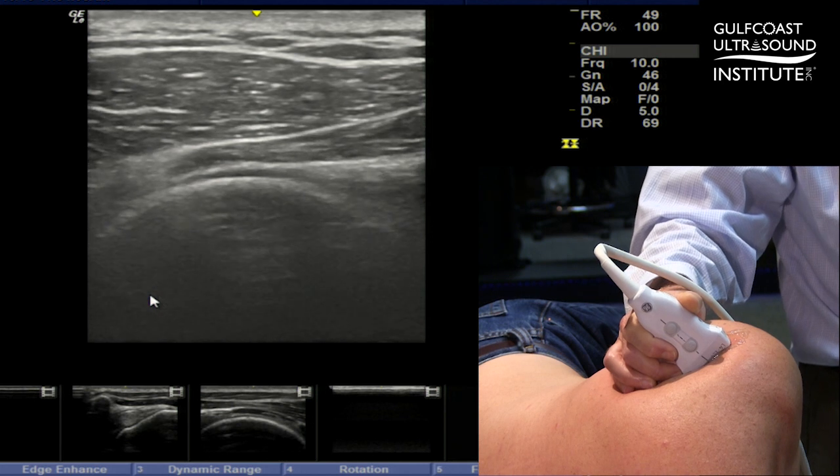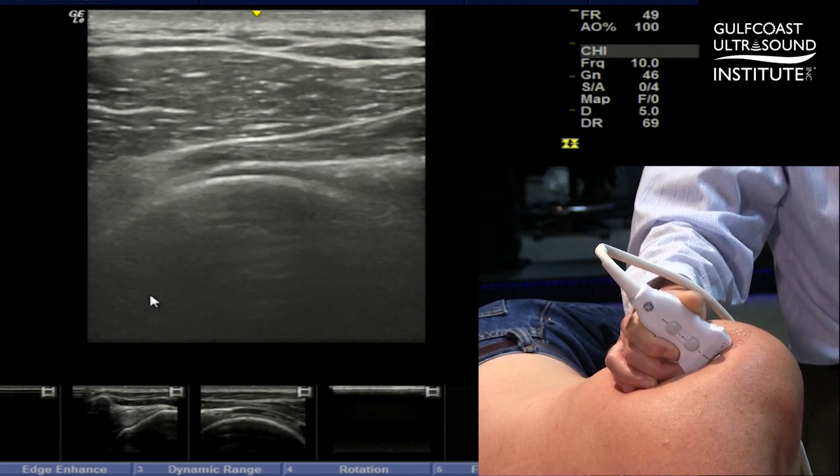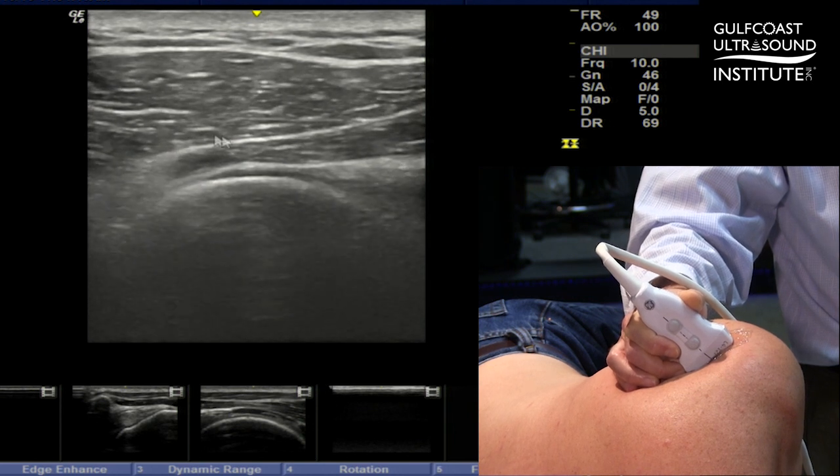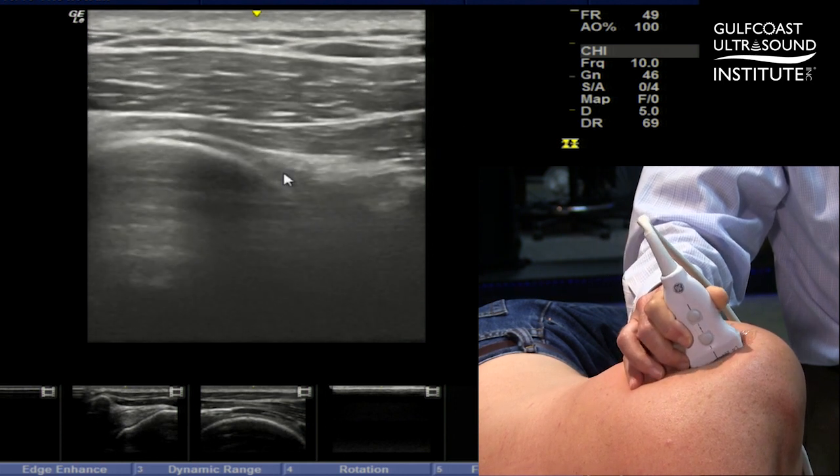You can explain this to the patient — they may feel some pressure — but it helps with the trajectory of the needle going from a lateral to medial approach, and it gets that humeral head and its convexity out of the way so it's not going to block your view as it would in the original position.